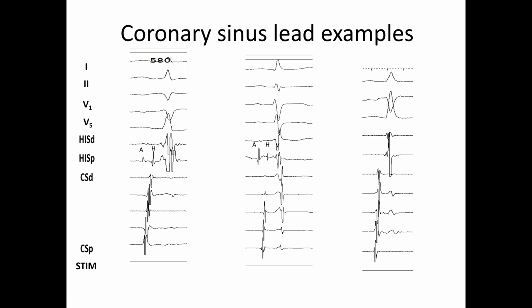Whereas if we look at the middle slide, you've actually got quite a sharp atrial signal, and the far field ventricular signal is also quite sharp. And on the right, you've got very far field looking ventricular signals.